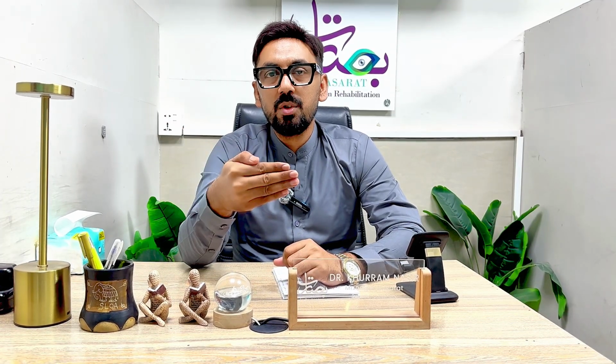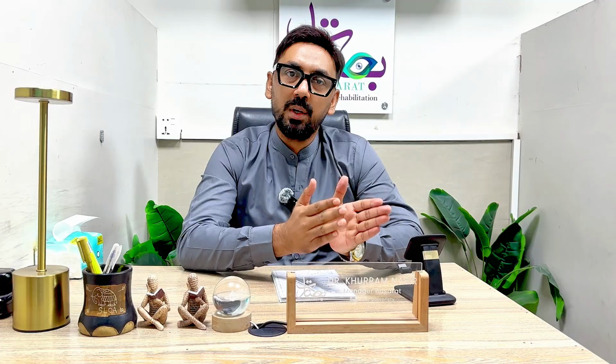In the easiest way, what is Dk over t value? It means the ability, the property of the lens to let oxygen or water penetrate through the surface of the lens towards the cornea. This Dk over t value is very important for the health of the cornea. In hard lenses this property was zero, nothing. So these hard lenses are obsolete now, and have been replaced by a very important type of lens, the RGP lenses.